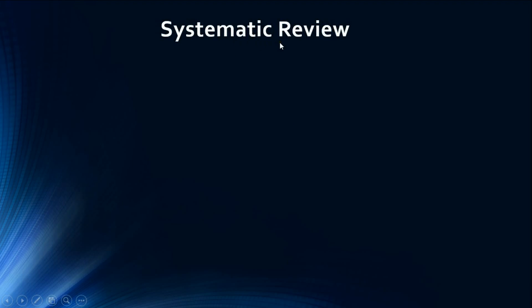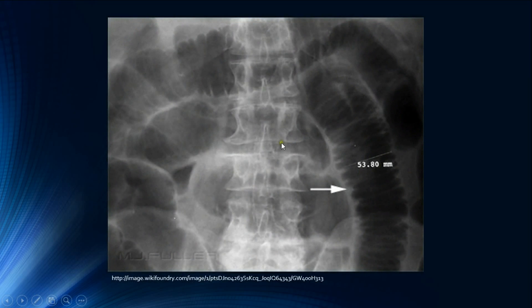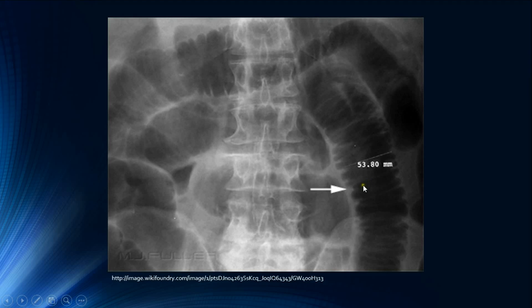The systematic review begins with 'G' — gases — covering bowel and free gas (pneumoperitoneum). We identify small and large bowel, measure bowel diameter and wall thickness, and look for pneumoperitoneum signs. The small bowel is central, has mucosal folds called valvulae conniventes appearing as a stack of coins traversing the full diameter, and normally measures less than 3 cm in diameter.